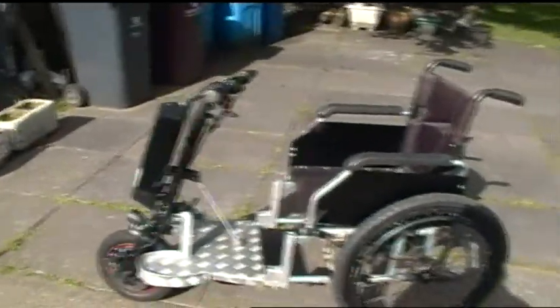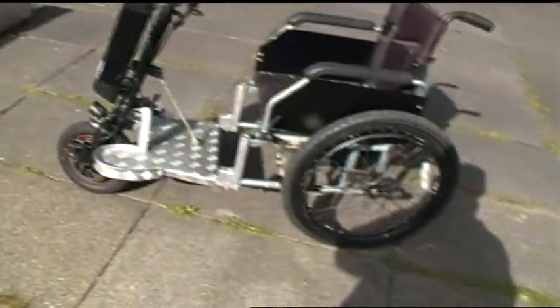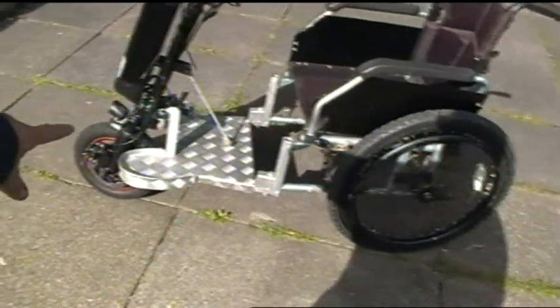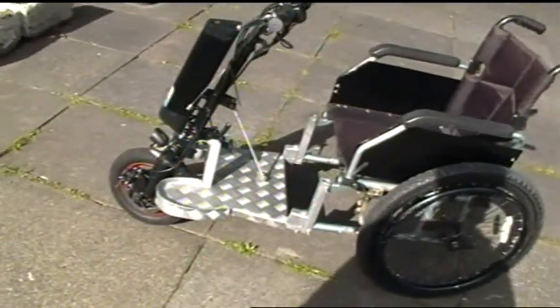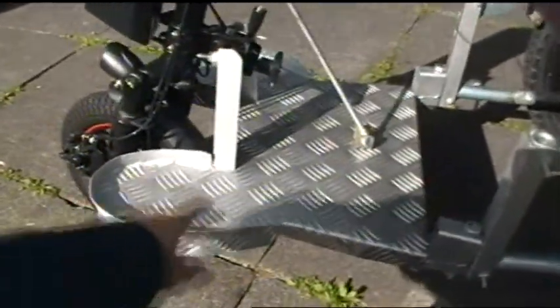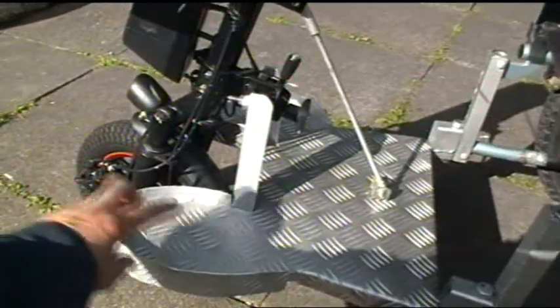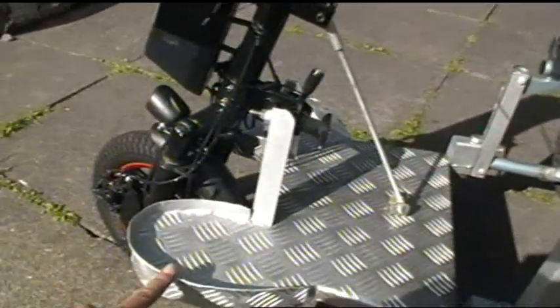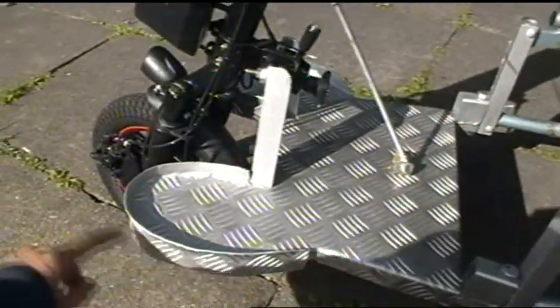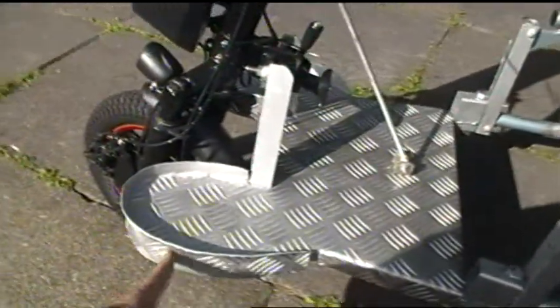This is how the wheelchair's pretty much turned out in the end. I dropped the front end a few inches, and I've fitted checker plate on it, and I've basically drawn around one of my shoes, size 12 shoe, not likely to be anything any bigger than that, sat in there, and I've welded this checker plate around the edge, done that on the two sides.